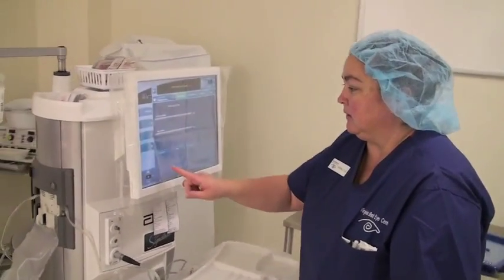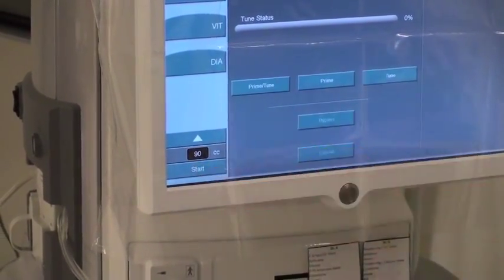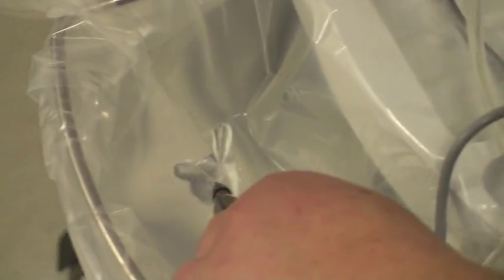Now I'm going to hit start here, and this is just going to put some of the BSS solution inside the bag for our surgery. We have it set to 90 seconds, and that's just going to put a nice amount in to fill it. You can see it's coming down the tube and filling into the bag. When it's done, it'll stop automatically once it's filled.